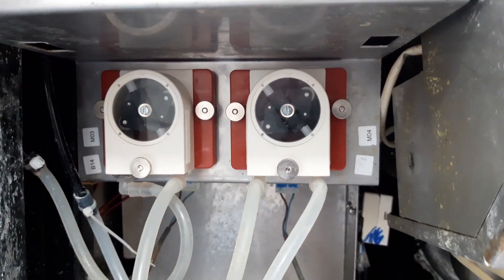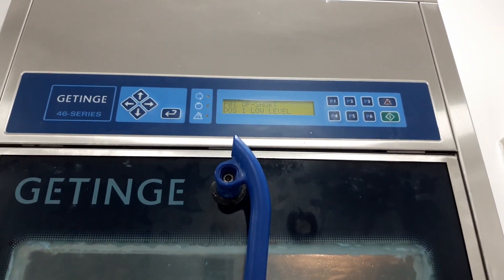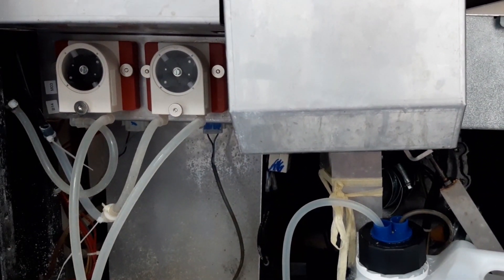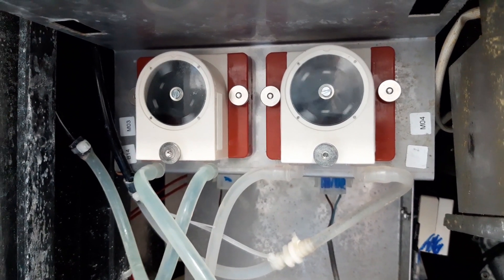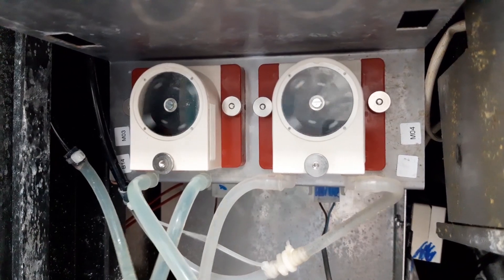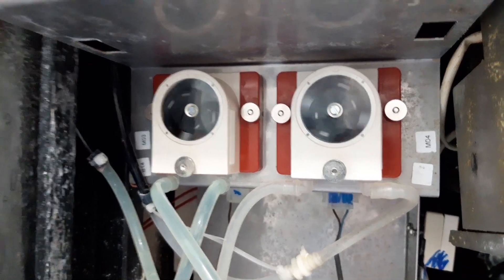So now I have connected those pumps, and what we are going to do is run the unit and check if these two pumps will work properly. We are waiting for the unit to heat up. As you can see guys, the pumps are now running. So far it is running good.